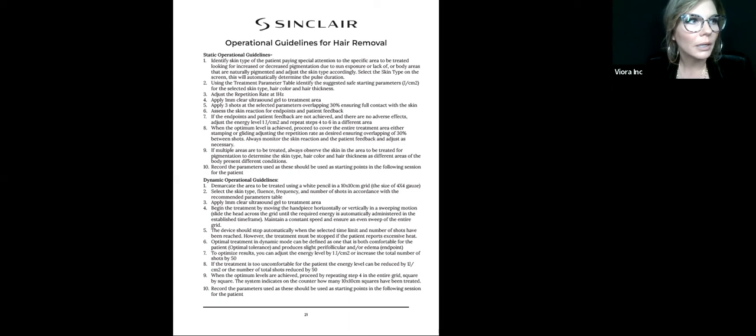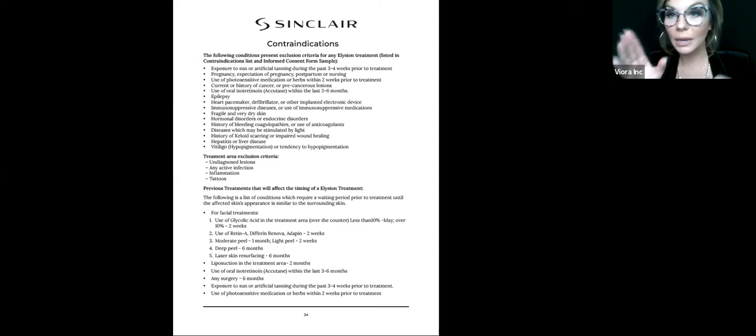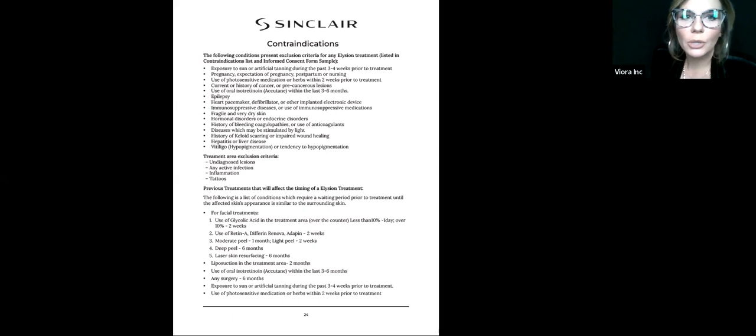Okay, now since I have time, what I was really going to do, and then I stopped on that page, is I will go through the contraindications since I have the time to do so. Okay, so here's our list. They're also going to be on the consent form.